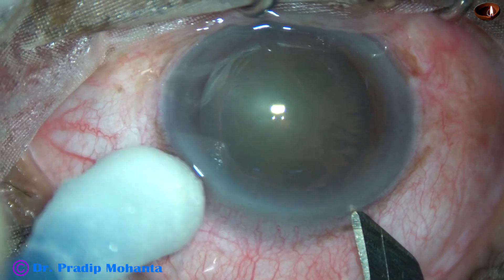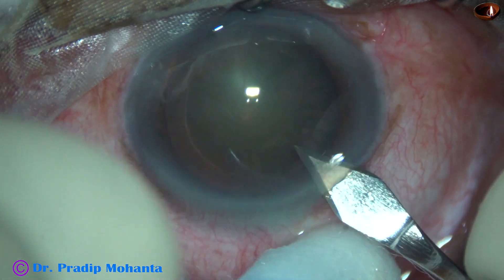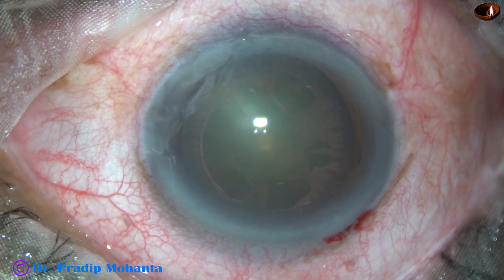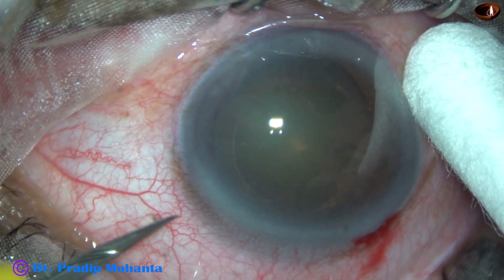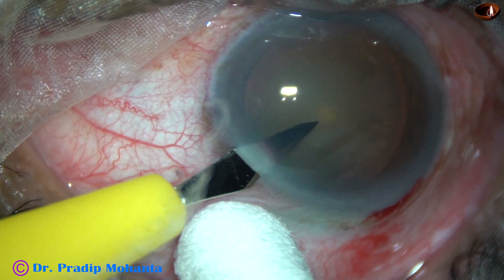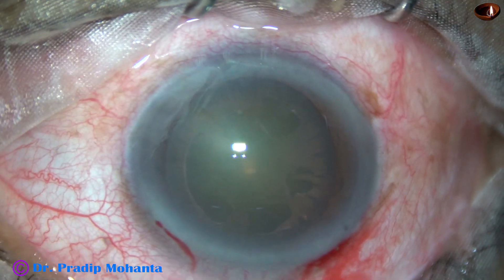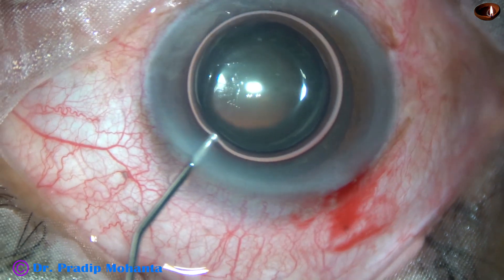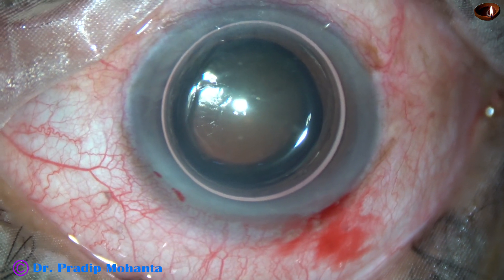This is the main incision with a 2.8 mm steel keratome on the posterior aspect of the limbus. A side port is being made on the left side of the main incision, about 3 o'clock hours away. We can see oozing of blood from the lips of the wounds, which means these wounds include some capillaries.